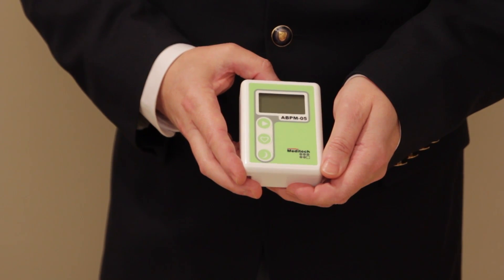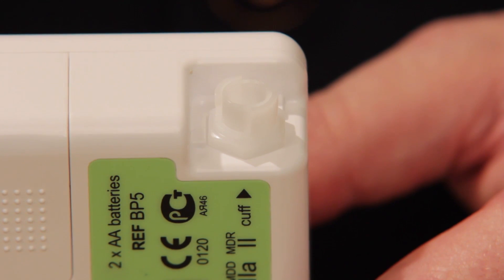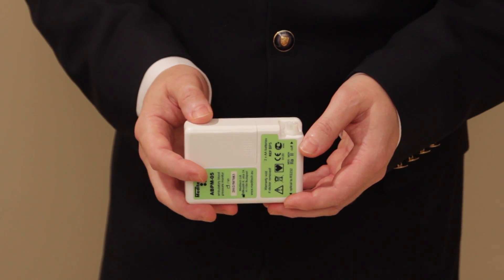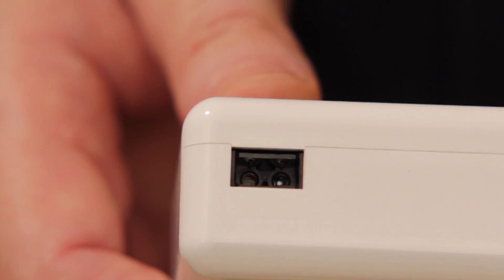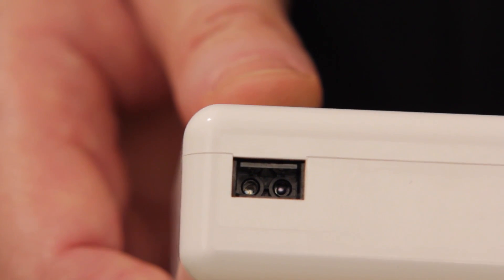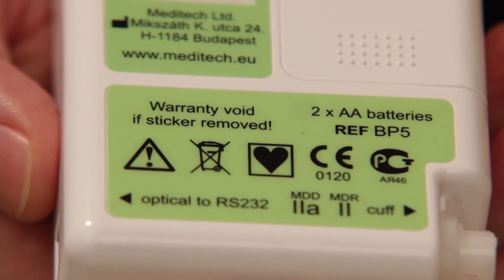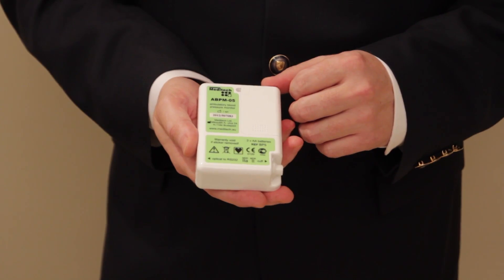The device itself has two major connection points. One of them is where the cuff is connected with its tubing — the cuff is an upper arm type cuff. On the other side is a connection for the computer cable, the optical USB cable. On the back side, this is also indicated: the cuff connector and the optical connection to either a serial port or a USB port.